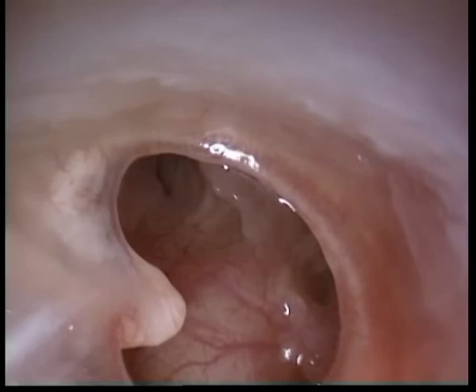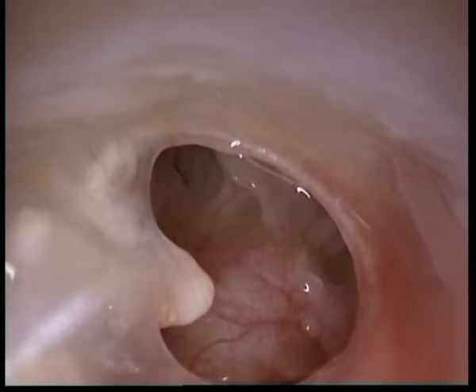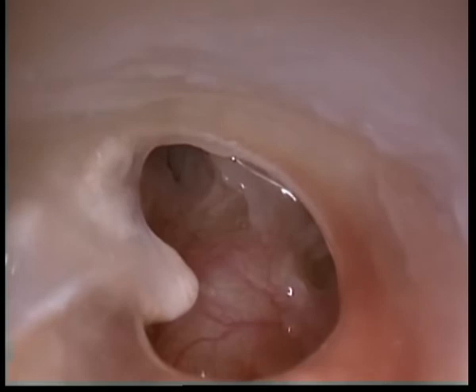Now you can see the vessels have all branched out, so I know I've done my job. Should not be really seeing any blood vessels.